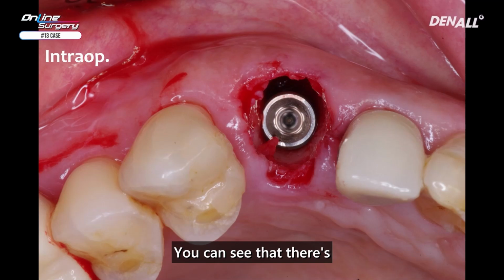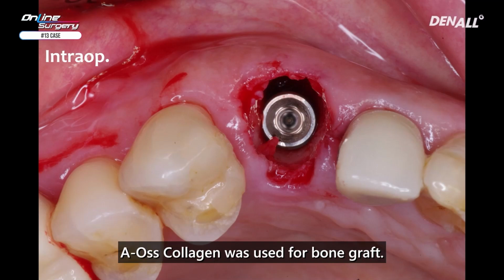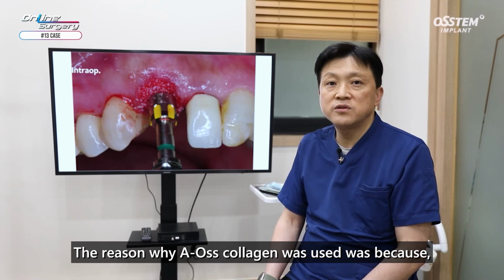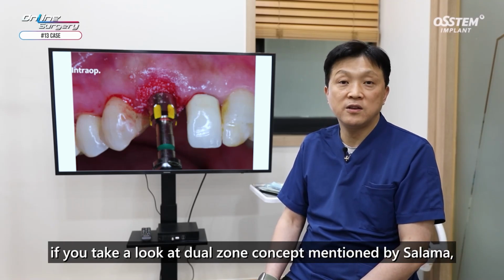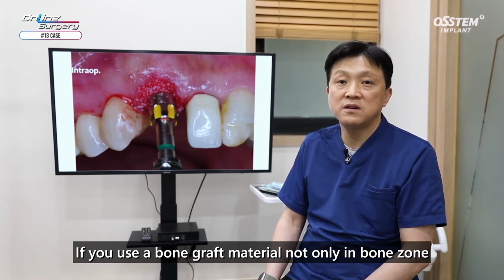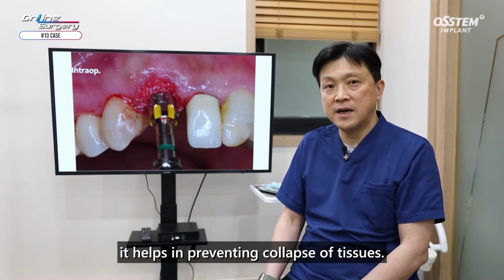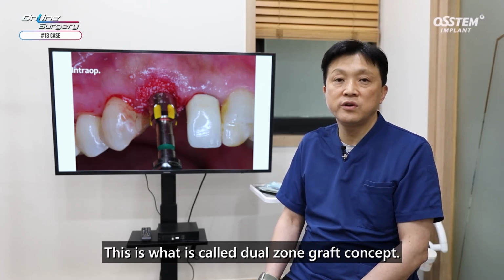You can see that there's significant buccal gap after implant placement. A-OssCollagen was used for bone graft. The reason why A-OssCollagen was used was because if you take a look at dual zone concept mentioned by Salama, there's a bone zone and a tissue zone. If you use a bone graft material not only in bone zone but also in tissue zone more so than augmentation, it helps in preventing collapse of tissues. So this is what is called dual zone graft concept.